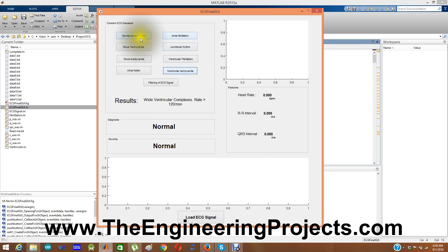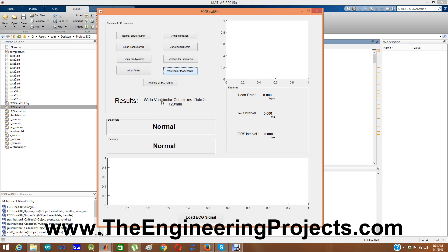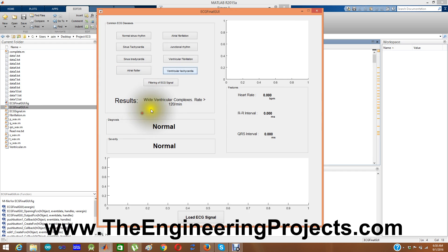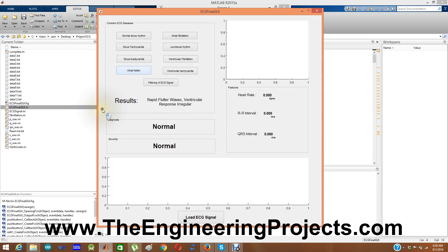I have added a total of eight diseases here. Whenever you click any button it will show you which disease this ECG signal has. For example, when I click on ventricular tachycardia it says: wide ventricular complexes, rate greater than 120 per minute. If I click on atrial flutter it will show: rapid flutter wave, ventricular response irregular. This section of the GUI uses predefined signals and displays them on each button press.